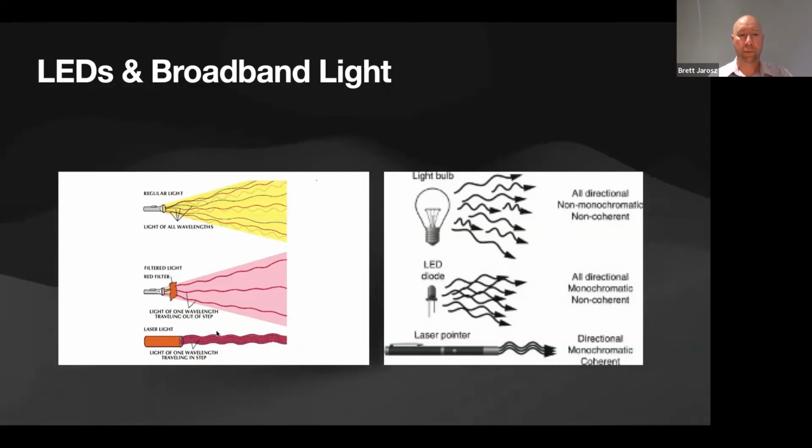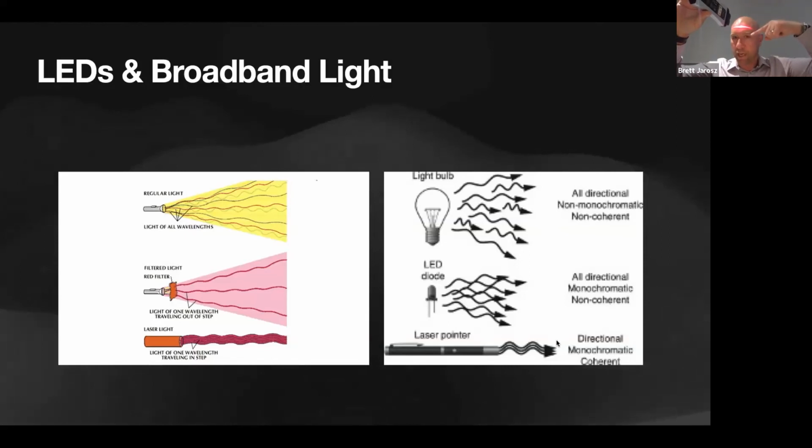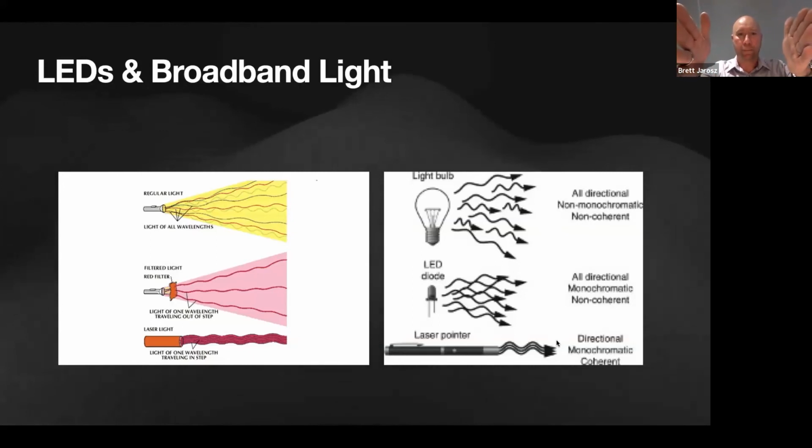non-coherent. Okay, so when we look at a laser, a laser has directionality to it. Obviously we saw here with this particular laser, with their patented light beam, we can actually see that straight line directly onto my forehead there. So it's monochromatic. I've got the red being the 635 in this case. I've got the violet being the 405. So I've got monochromatic violet. I've got monochromatic red. It's coherent, meaning all of those monochromatic photons are traveling in the same direction. Okay, so if it's non-coherent, they're not traveling in that same direction.